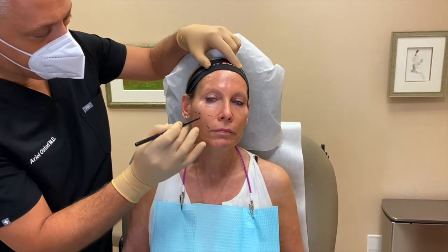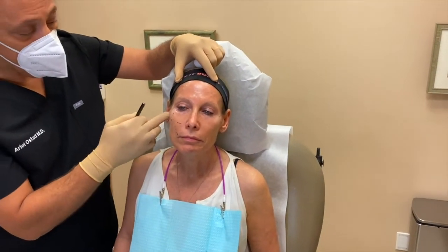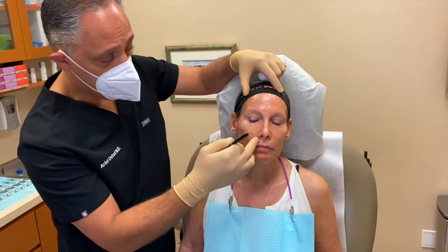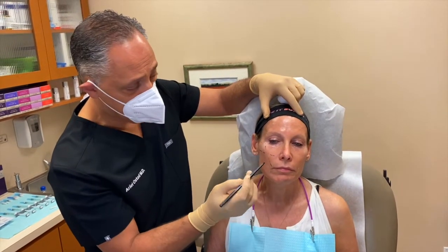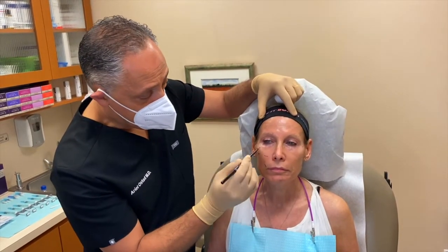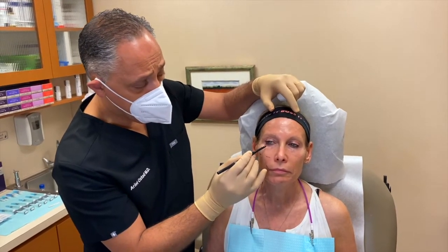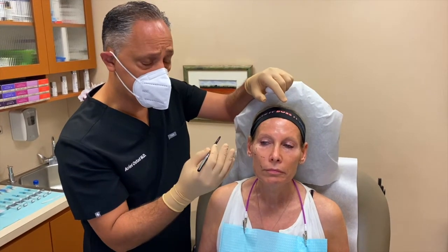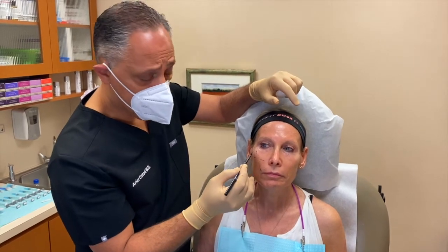I do this just to show it to you. When I'm actually treating a patient, I will not draw these lines. But I do it to show you that there are scientific principles: if you draw a line from the tragus, which is the cartilage in front of your ear, down to the corner of your nostril, as well as a line from the corner of your eye down to the corner of the mouth, we want to focus on this outer box here. She has a little bit of hollowness here, so you'll see me inject here. You can see this puffiness from a filler that she's placed elsewhere, which she's not happy about. By putting in a little bit of filler, I'll be able to hide that even better.